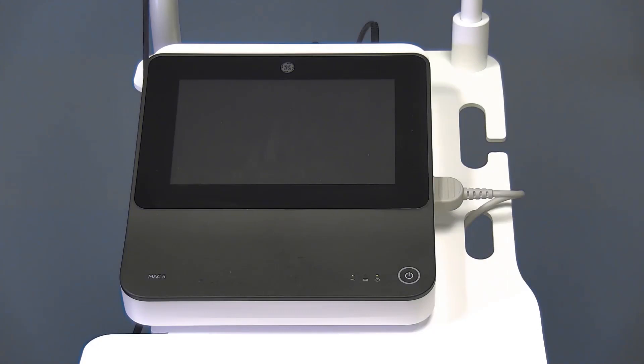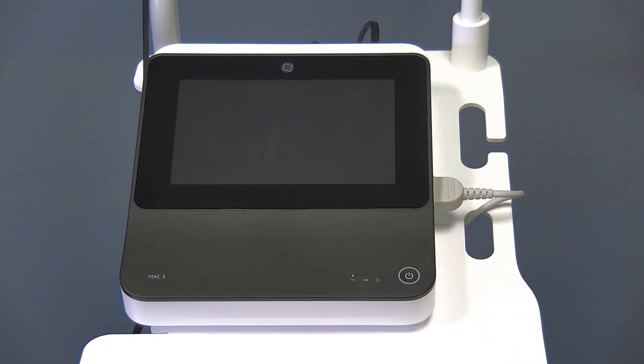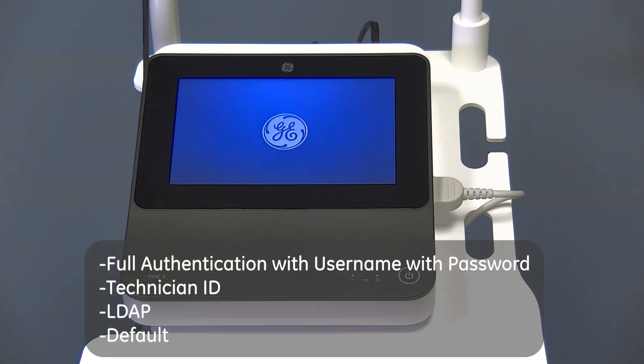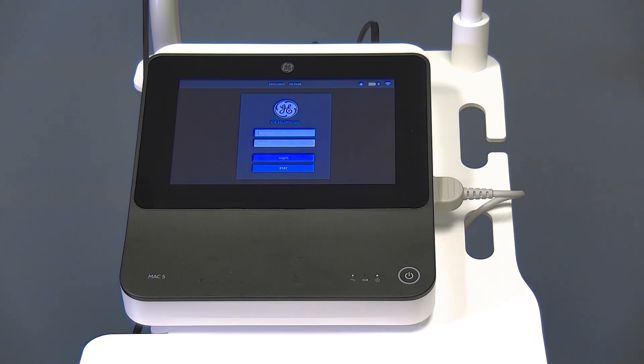The top surface of the device contains the touch screen, power button, and LED battery indicators. Once the device is powered on, the MAC-5 can provide several authentication methods, including full authentication with username and password, technician ID authentication, LDAP authentication, or a default authentication. Your clinical administration team will have configured the authentication method prior to use.